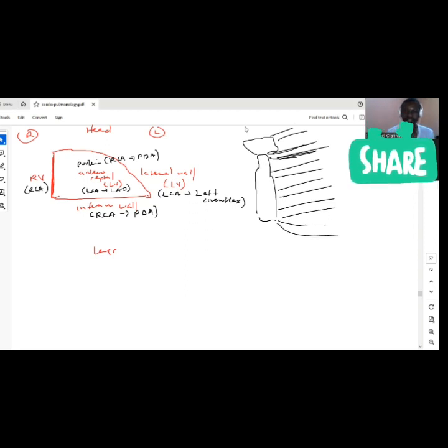On that side, this is my right side, this is my left side, the person's head up there, and their legs down there. So we have leads on the limbs, leads we're going to put on the limbs, and then we have leads on the chest. So the standard 12 lead ECG, right? We're going to have leads placed on the chest.